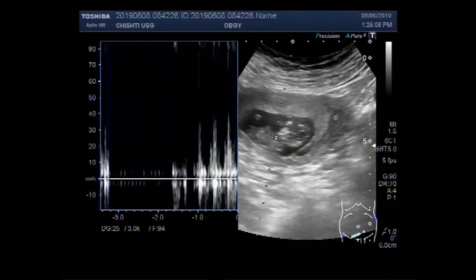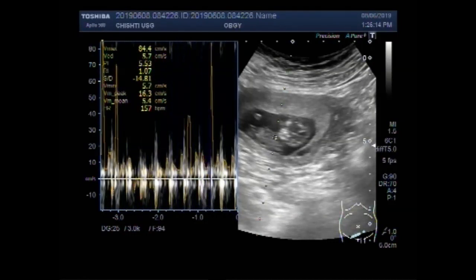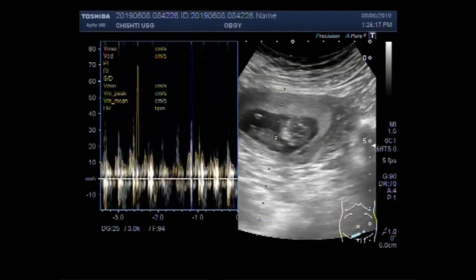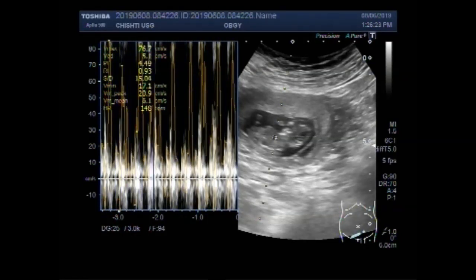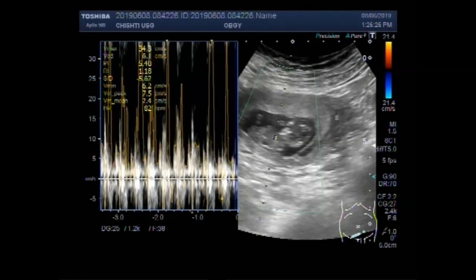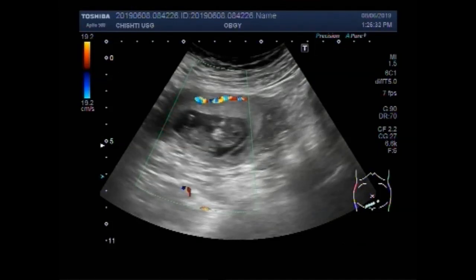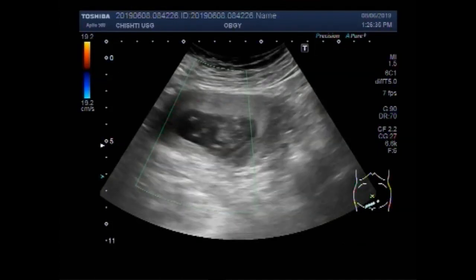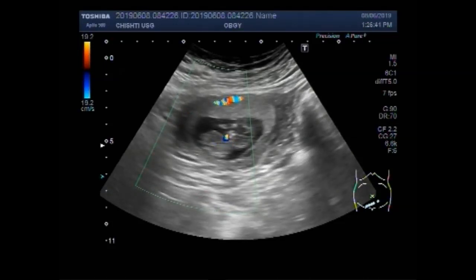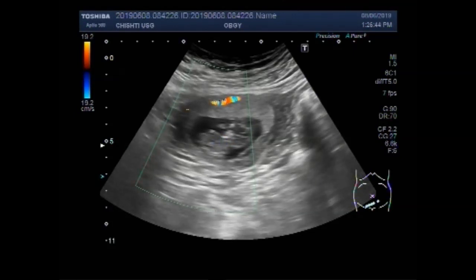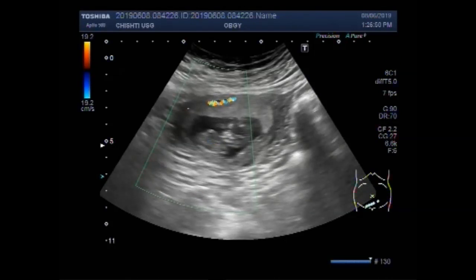Now you can see the normal fetal cardiac activity. The cardiac activity is visible and audible. The normal fetus will continue to grow and have normal development.